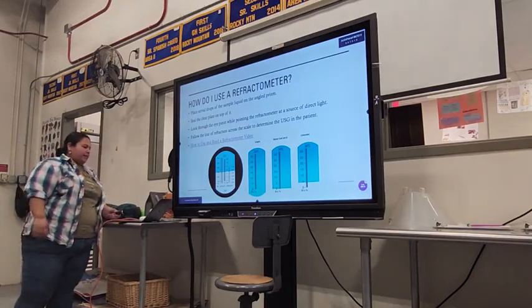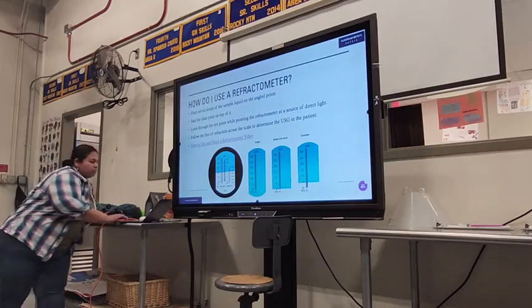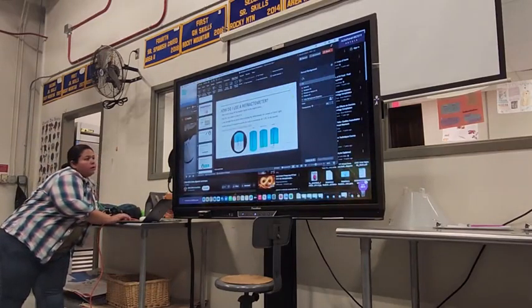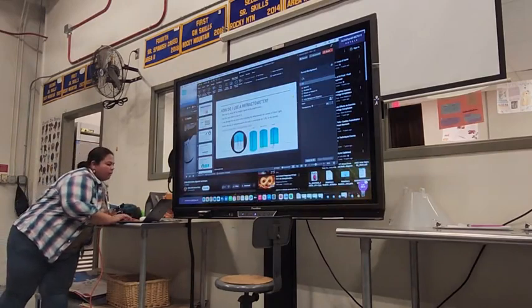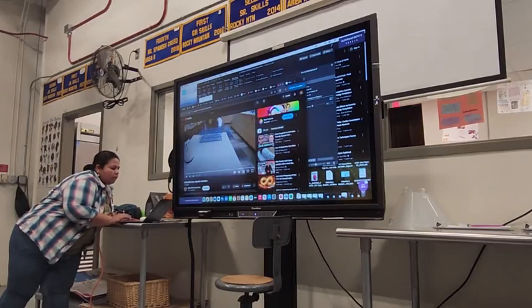Hi, I'm Dr. Evan Matthews. I'm here at Montclair State University in Exercise Science Lab to show you how to do urine-specific gravity using a refractometer. All you have to do is take the refractometer, open up the top, and put 2 to 3 drops of urine using a transfer pipette in there's a little sort of circle hole underneath the glass of the refractometer.